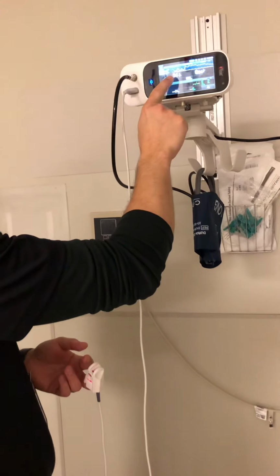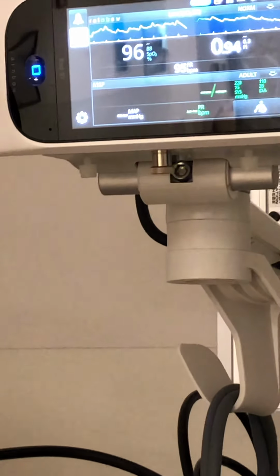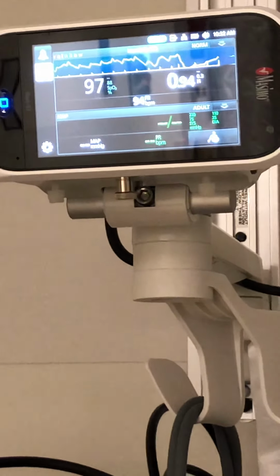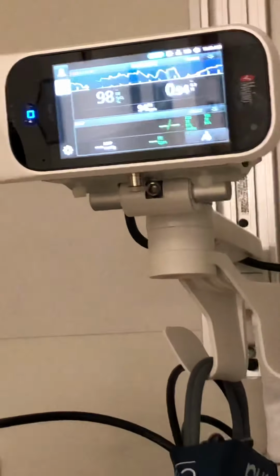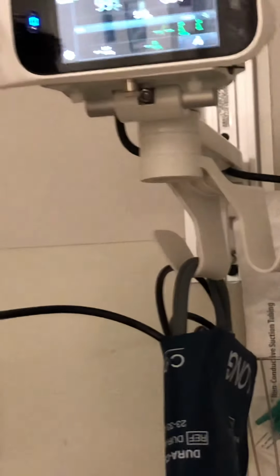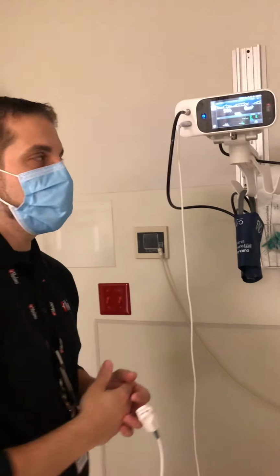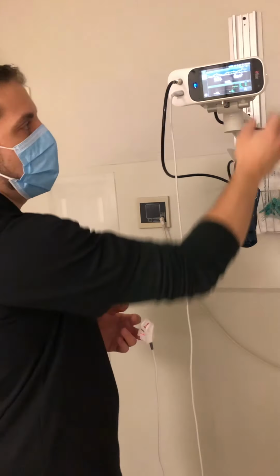And just to show you guys, you can see the SpO2 value. It's no longer bright white, it's actually a light gray color. Light gray means we're starting to lose confidence in the signal but haven't lost complete confidence. So if you have a patient like me, we actually offer what we call sensitivity settings for our SpO2. There's actually 3. And the way you adjust it, you can see in the top right-hand corner, we always default our monitors to what we call norm, which is our middle sensitivity.